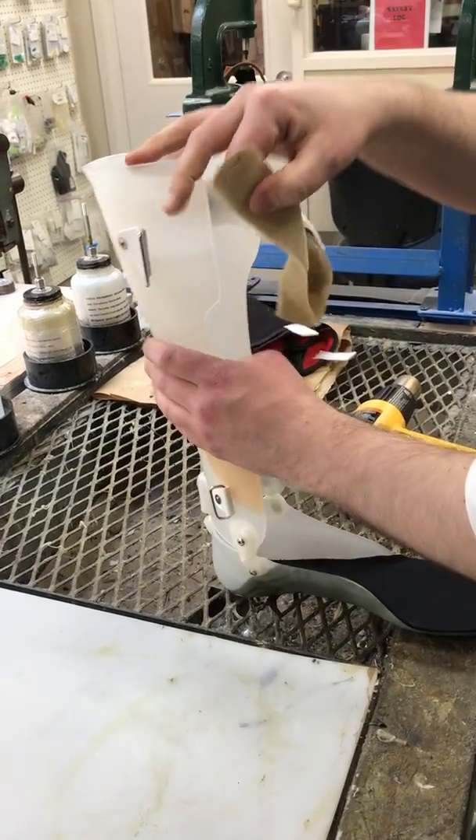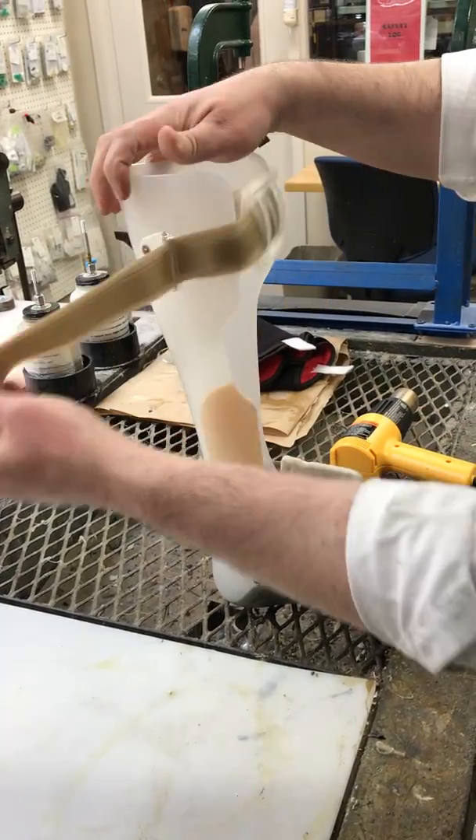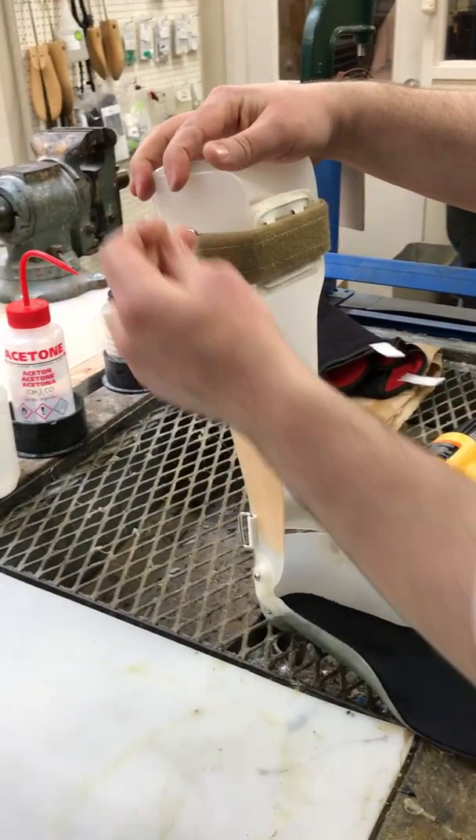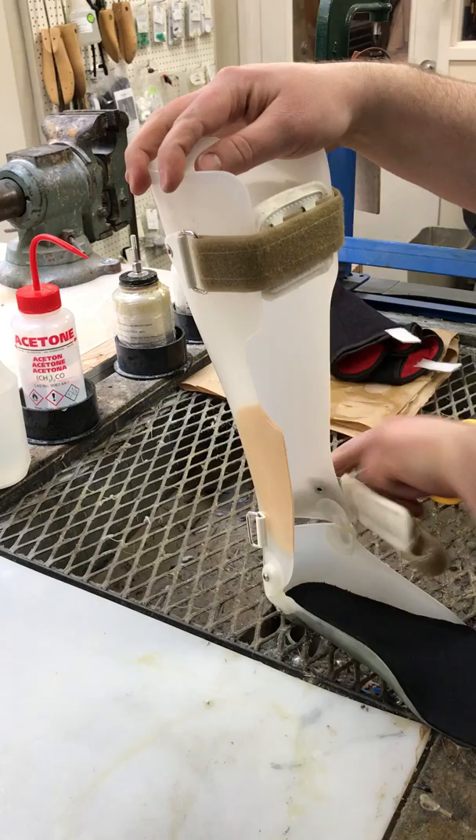On the patient, you will take the velcro straps and tighten down the plastic to where it needs to be and mark it on your velcro straps.